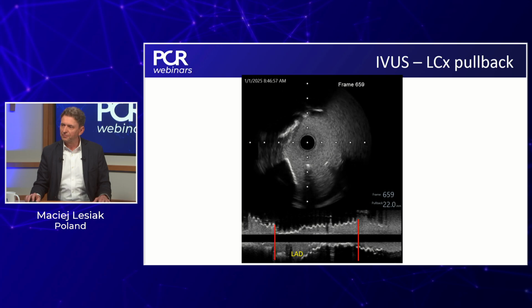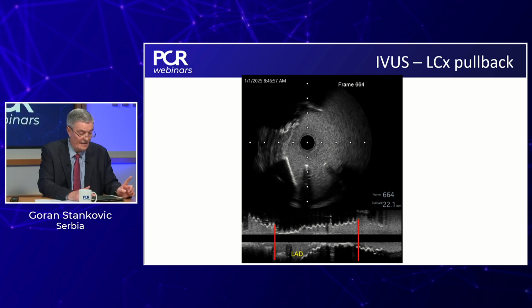I have to stop you because two very important questions for you are coming. Dr. Zaran is asking, any concerns about rota in severe tortuosity and acute coronary syndrome? And Dr. Papanicolaou, what about orbital atherectomy after imaging due to tortuosity?